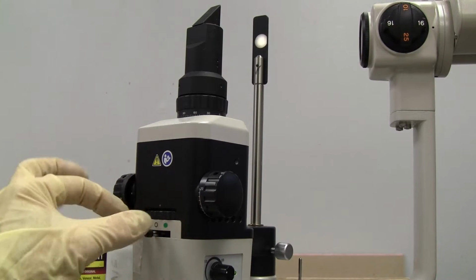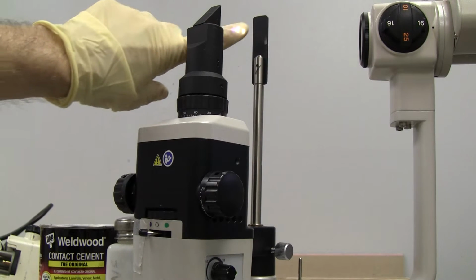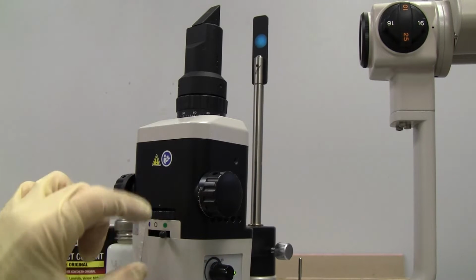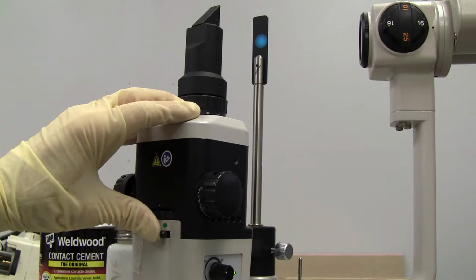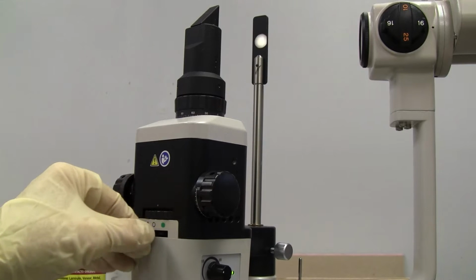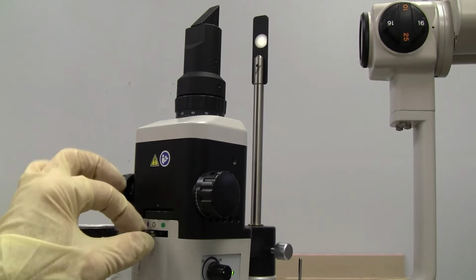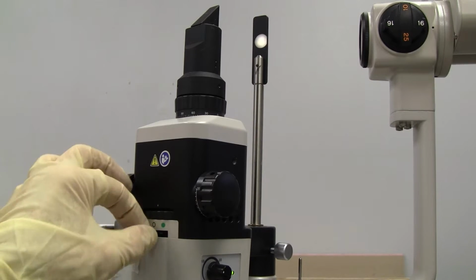if it's not in the right place, when you flip it to the color, it doesn't go all the way one way or the other because it's misaligned. Even though this is at the end, still got some more room, so it's not aligned. So this happens fairly often. This lever's small and it can get loose and then get out of alignment.